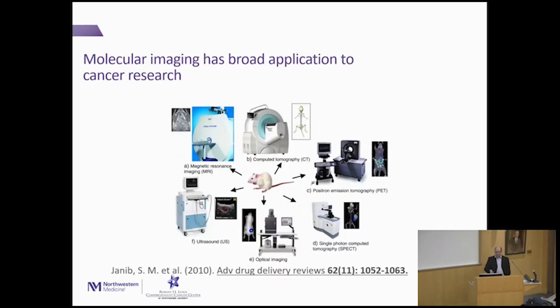So this is a representation of all of the imaging that's available for small animals. The only one that isn't related for clinical use is optical imaging, but I'll touch on that very briefly. The only thing that we don't have is ultrasound.